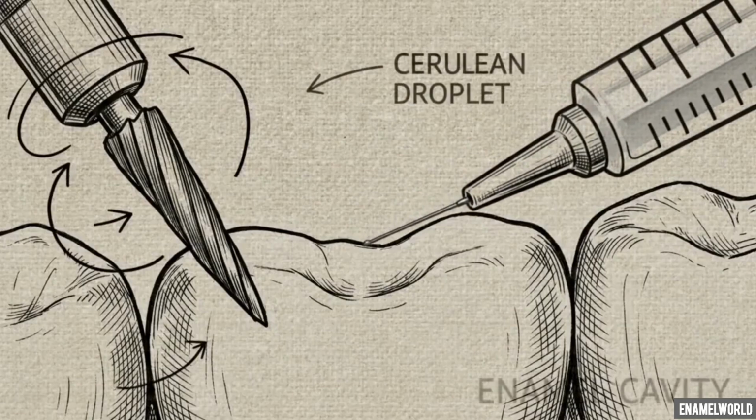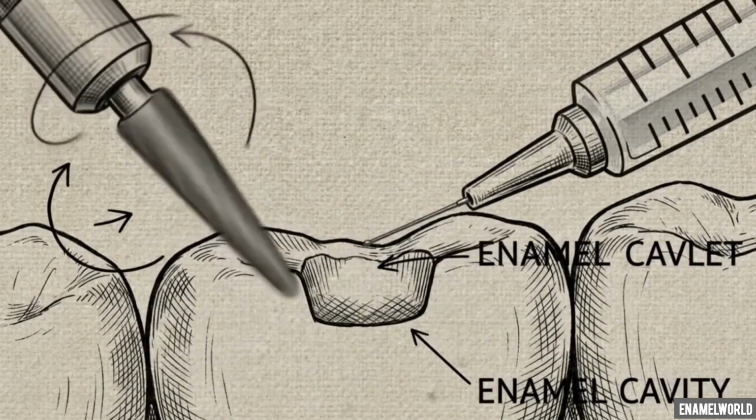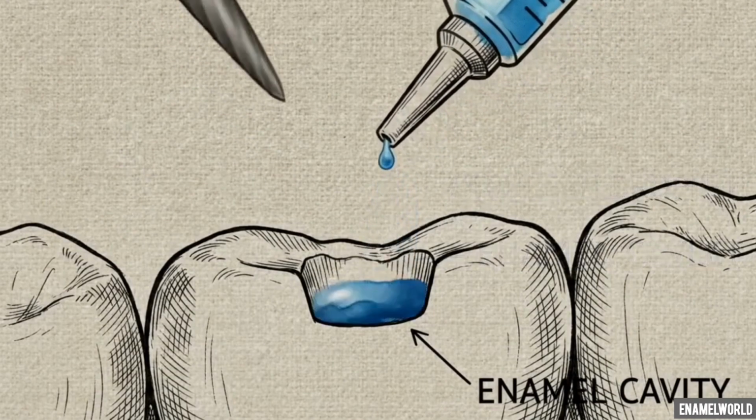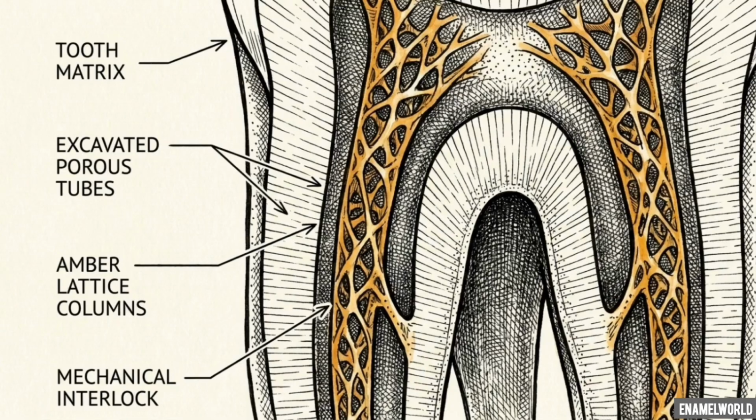However, this complex chemical web has no natural affinity for human tooth structure. Successful placement requires conservative cavity preparation paired with precise chemical conditioning. Clinicians must use a 37% phosphoric acid etch and a specialized bonding agent to create microscopic retentive tags in the dentin, mechanically interlocking the composite to the tooth.